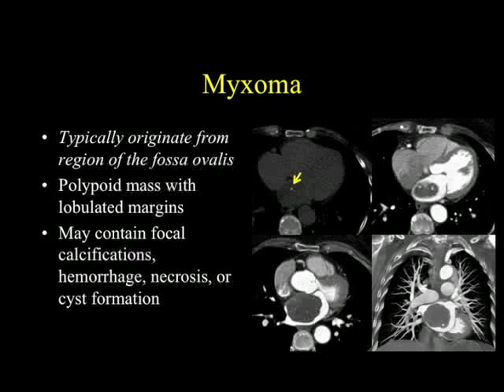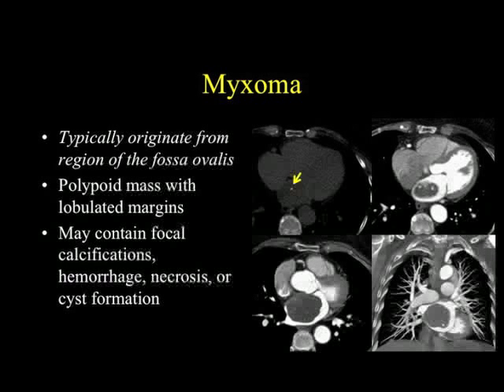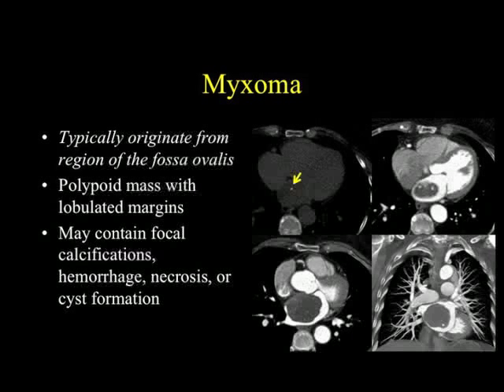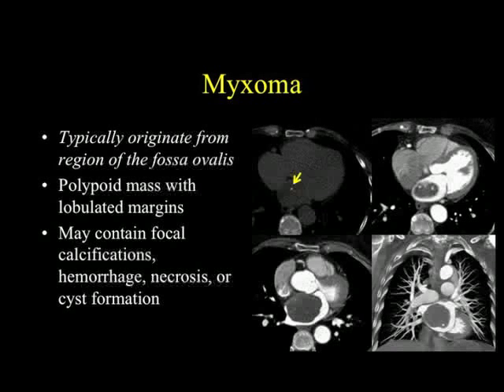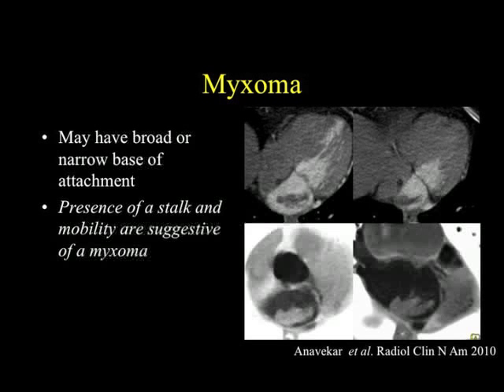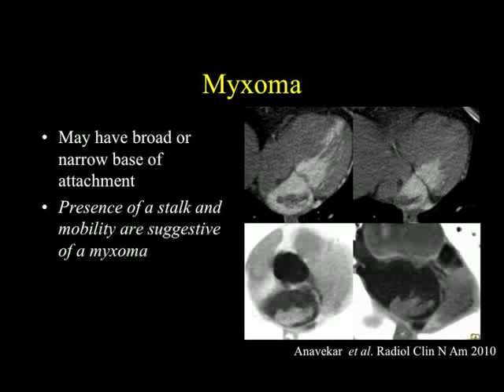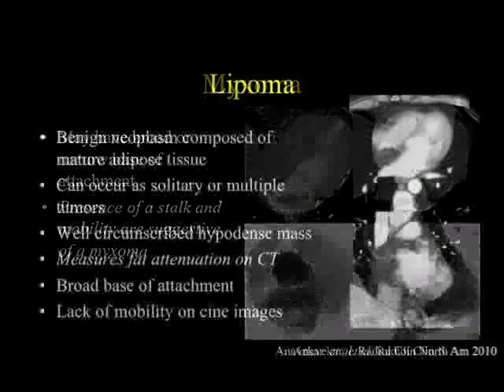You can see it very nicely in this case as a polypoid mass with lobular margins. It may contain focal calcification, hemorrhage, necrosis, or cyst formation — calcification is the most common finding. A question always comes up: can thrombus calcify? Anything could calcify, but it needs to be a really long-standing thrombus. If I see calcification, I'm really thinking myxoma, particularly when it looks like punctate calcifications. A myxoma may have a broad base or a narrow base of attachment. Here was a great case where I thought there was a stalk present — it was irregular and larger than the base itself — and in fact it was confirmed as myxoma at surgery.